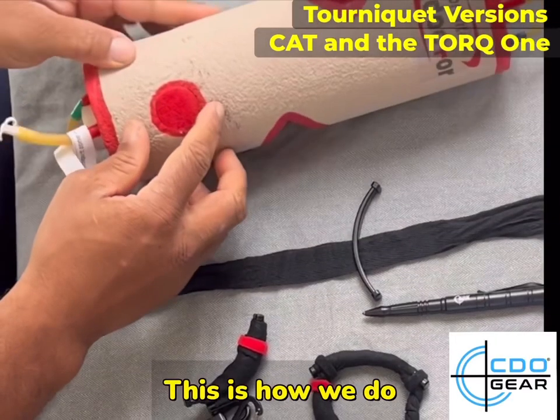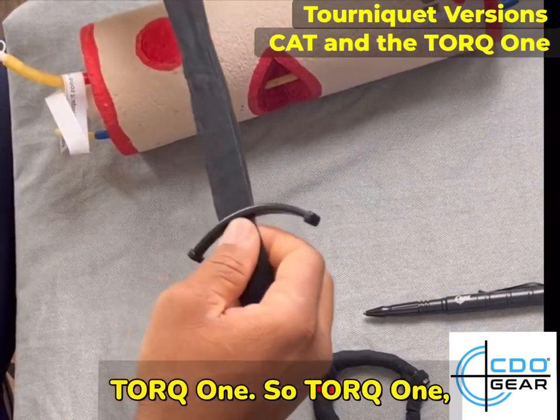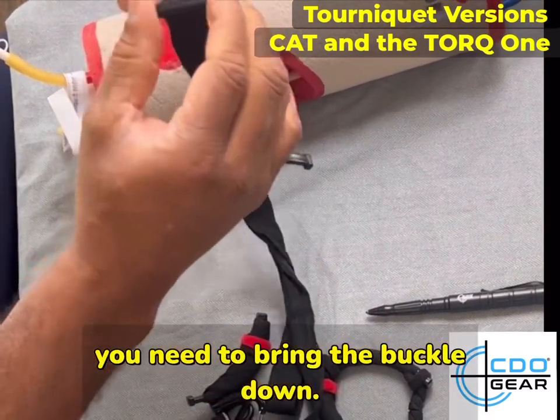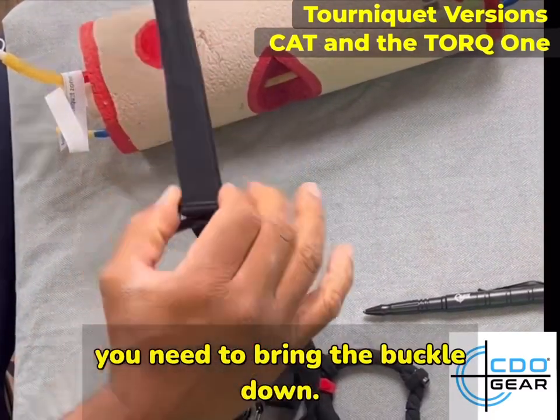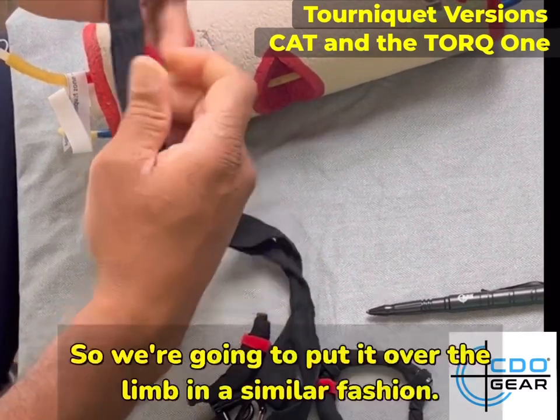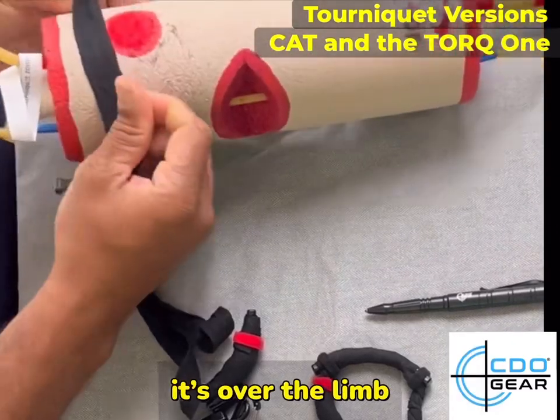This is how we do the torque one. So the torque one — when you take it apart, it'll look like this. You need to bring the buckle down and you're going to put this entire portion over the limb. So we're going to put it over the limb in similar fashion.